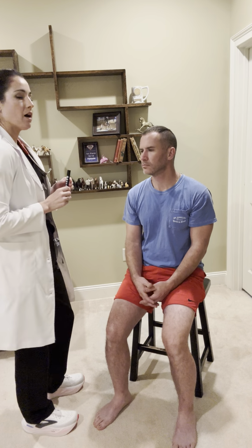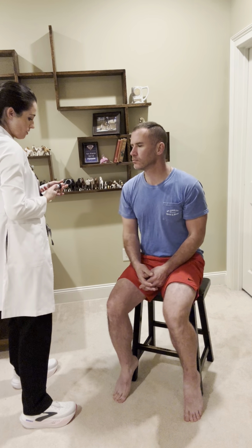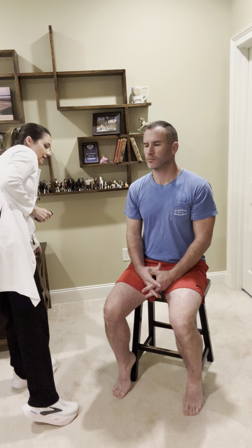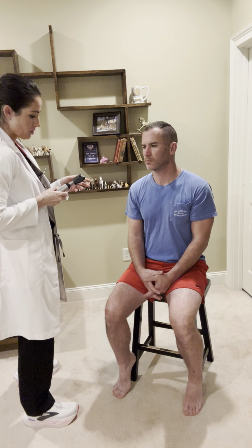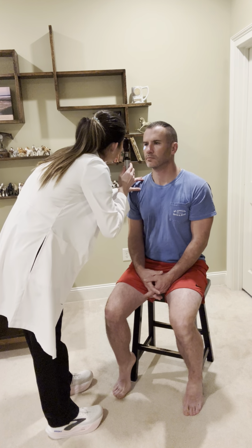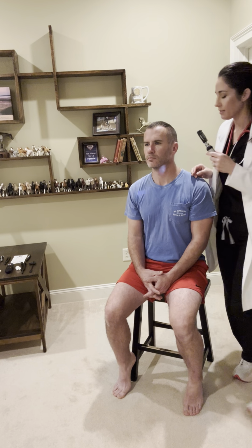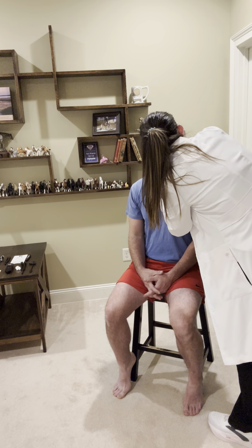All right. Next, we are going to inspect the eyes with the ophthalmoscope. We're going to look for red reflex and inspect the intraocular structures. All right, so right eye to right eye. All right, left eye to left eye. Okay.